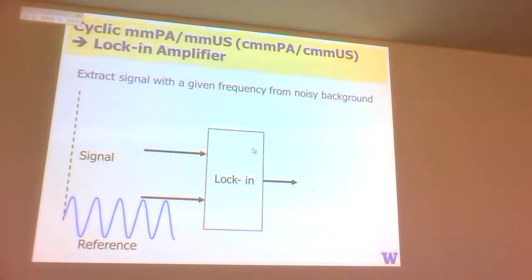What if you were making an image, and simultaneous to making an image, you put on an AC field? This field frequency is typically about 30 to 60 hertz that we're using now, right at the frame rates of the imaging system. What's going to happen? Well, if something is moving, like physiologic motion, which is not synchronous with your reference signal, if I do a lock-in detection or a correlation, think of it as a correlation detection between these two signals, I get nothing out, right?